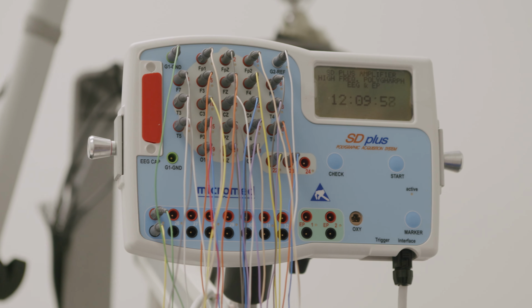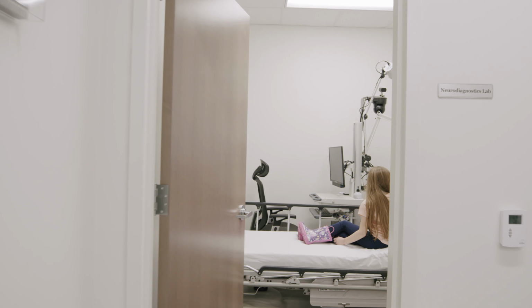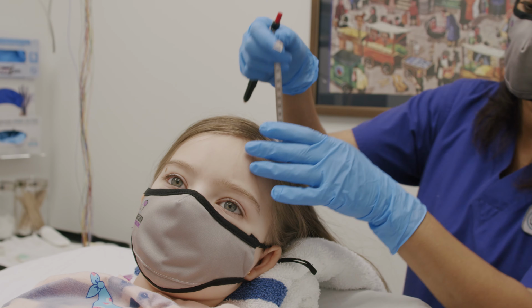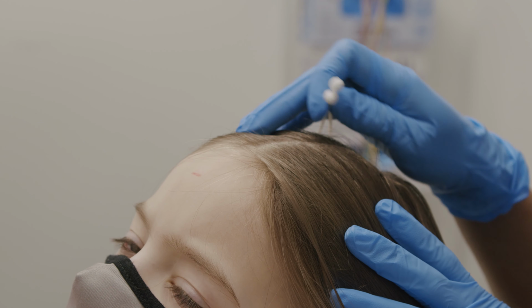EEG stands for electroencephalogram. It's a study that detects electrical activity in the brain. Your hair should be washed and dried before the study so that the electrodes have the best contact with your scalp. We'll start by taking measurements of your head, cleaning the areas where the electrodes will be applied.